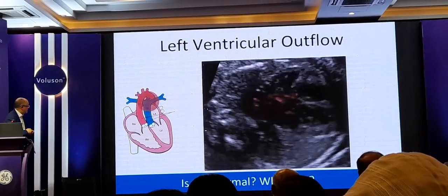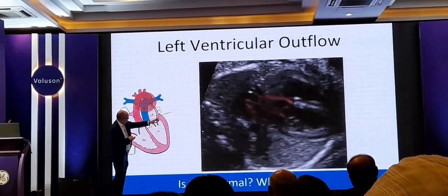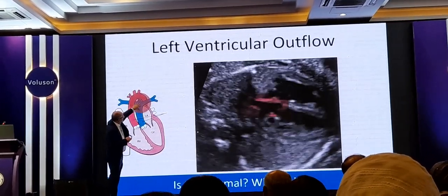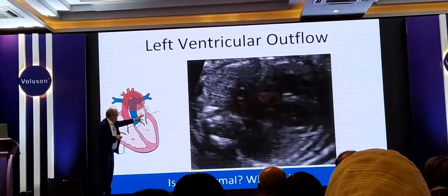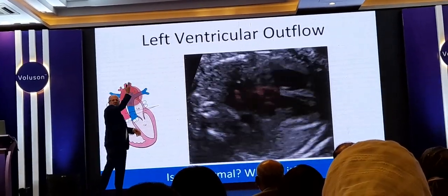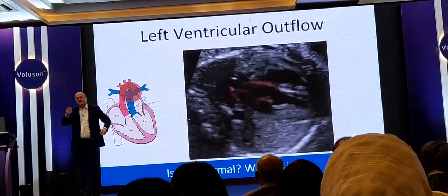Okay. And this is a picture here showing you the left ventricle split actually. From that left ventricular outflow tract, you can see it's dividing. But also, it's not the right angle, is it? Where's that nice curve that was? Remember that nice curve? So the pulmonary goes that way, and the aorta goes the other way.